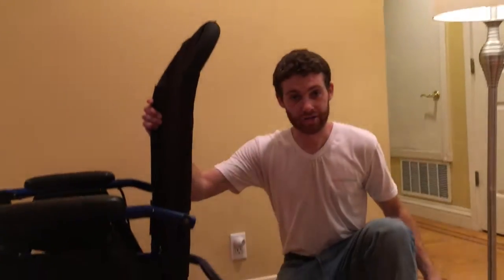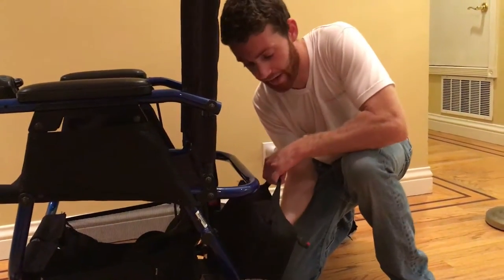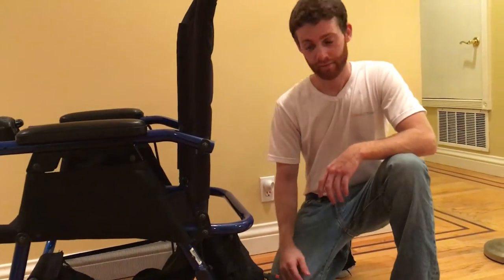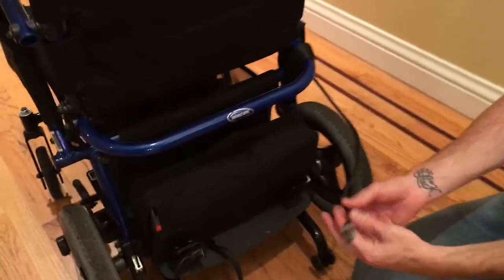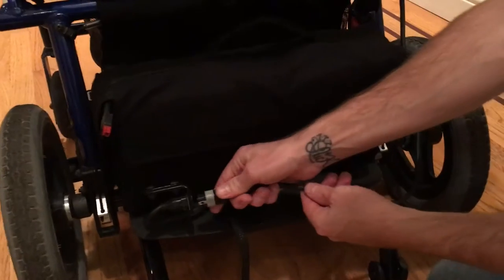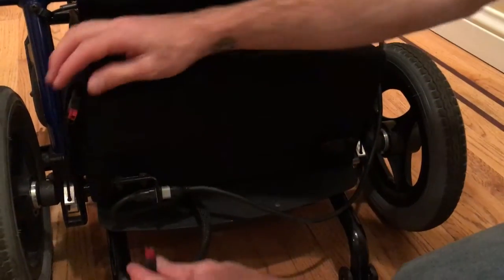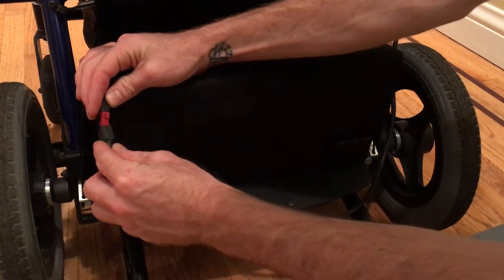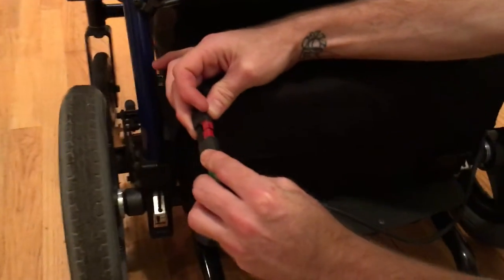Then we want to come around to the back and put in the battery pack. From there we have the cord that attaches here and the cord that goes to the actual battery pack and attaches right here — black on black and red on red.